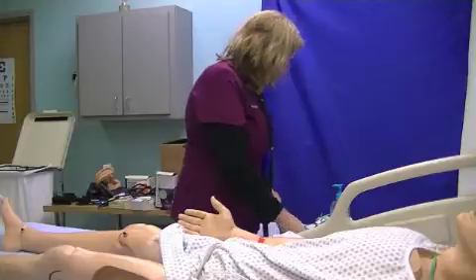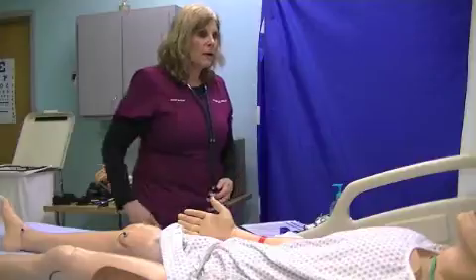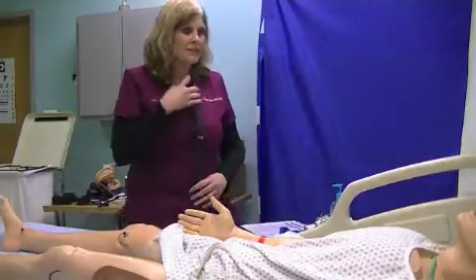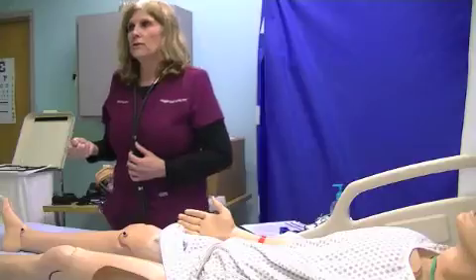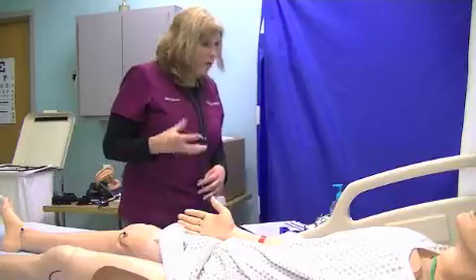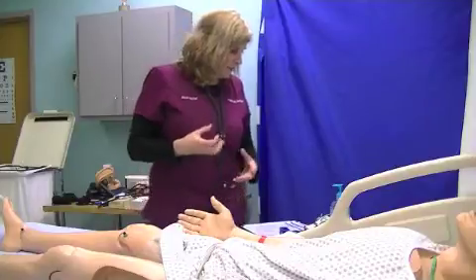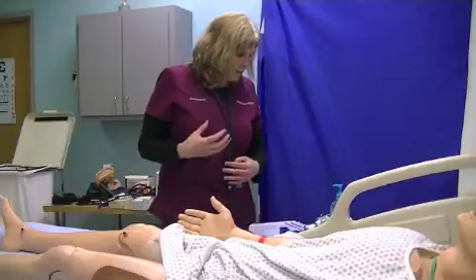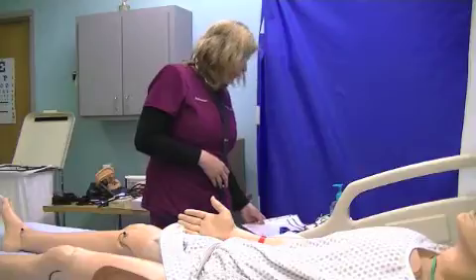Okay, blood pressure. Now the last one we're going to do is blood pressure. So when I do blood pressure, Mr. Pierce, have you had any caffeine? Have you smoked or exercised or had any stress? Okay, because caffeine constricts vessels, and caffeine will cause the blood pressure to go up. The same thing with nicotine, it causes vasoconstriction, which makes the heart work harder. Same thing with exercise or stress, you want to wait 30 minutes before you do blood pressure, because then you're going to get an accurate blood pressure.